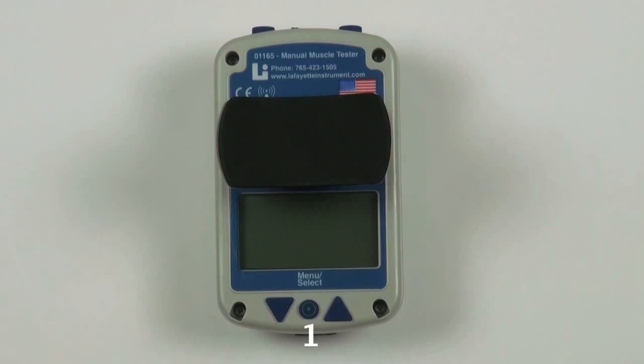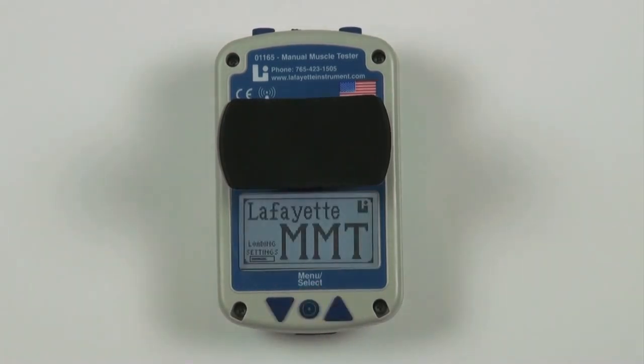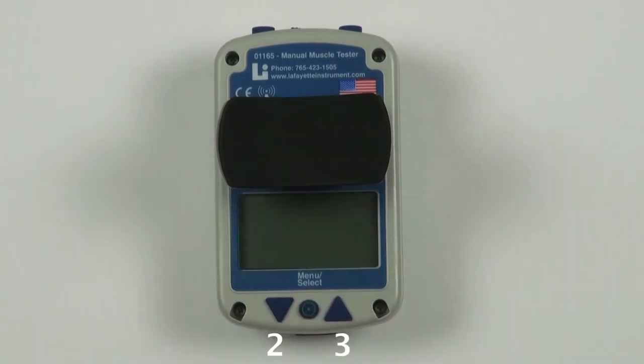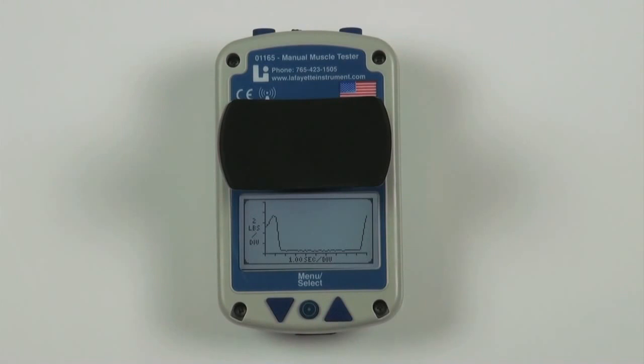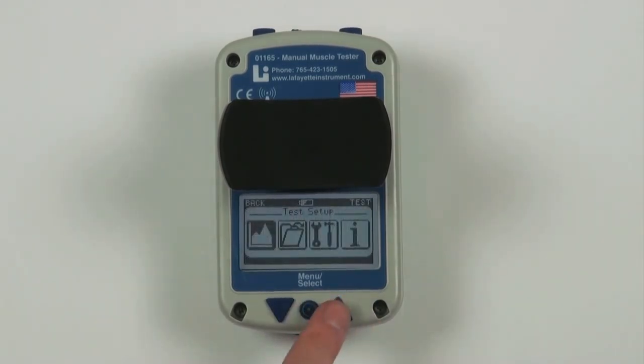Button one: the round menu select button is located on the bottom middle of the MMT. This is the button used to power on the device. The menu select allows you to enter into the menu screen and select various options within it. Buttons two and three are navigation buttons. While on the test screen, the navigation buttons are used to enlarge the graph and return back to the test screen from the enlarged graph. While in the menu screen, the navigation buttons are used to navigate the various menu screens.